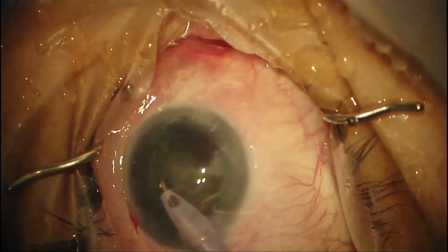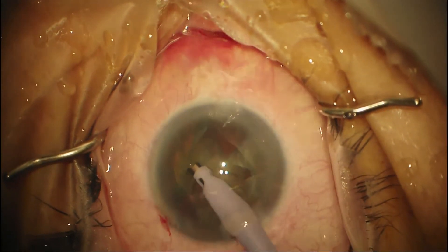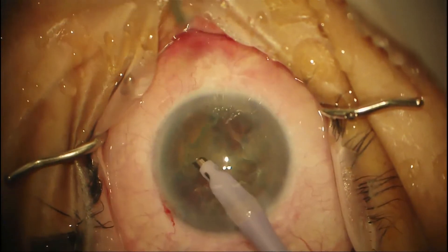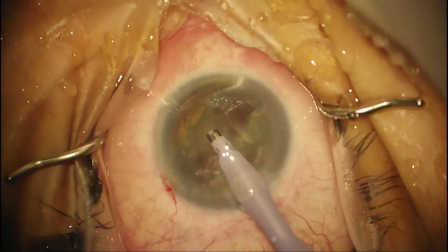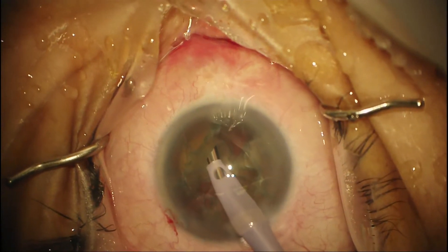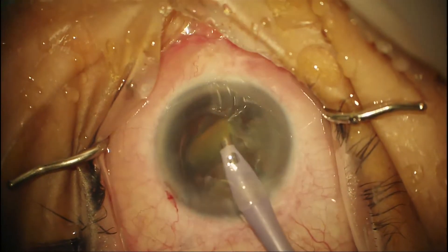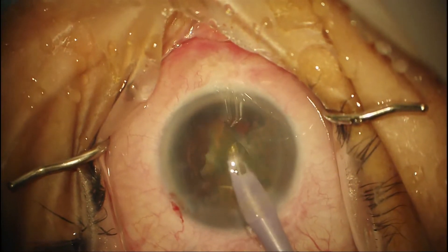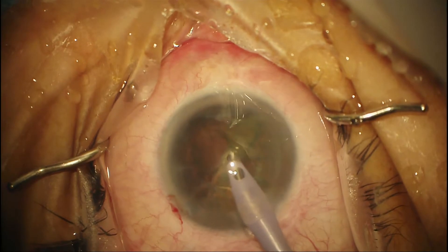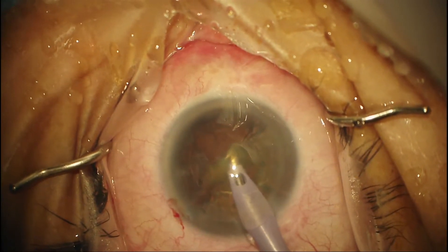Where do you grab? You always want to grab across from the incision. You don't want to be rotating the nucleus and trying to grab things sub-incisionally. You want to go across the eye and just under the anterior capsule and grab in a safe place. You never want to grab posteriorly by the tip of the pie piece — you always want to grab it by the crust, as it were. So we're bringing that fragment up and eating it in the iris plane.